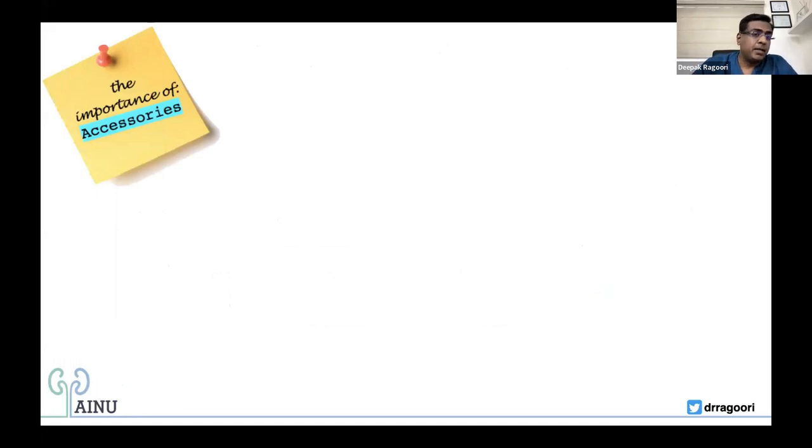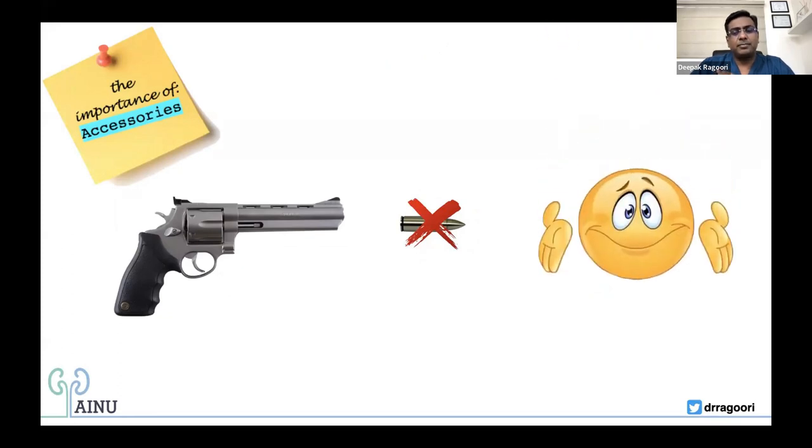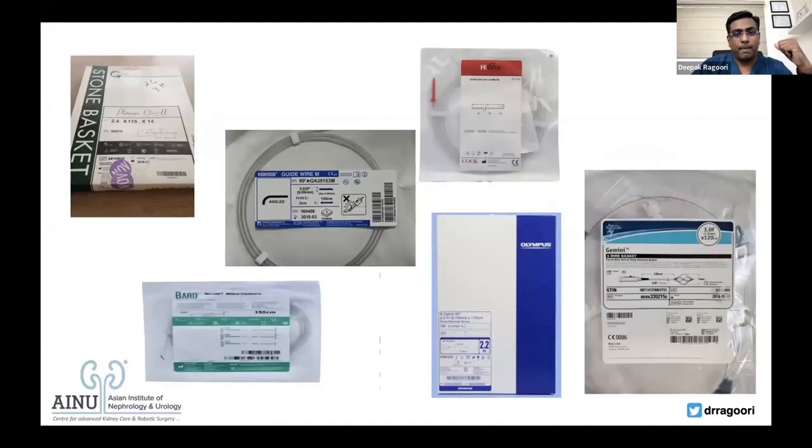So if I have to express the importance of accessories through a tiny animation or an example, imagine you have a very beautiful or powerful handgun in your hand and you realize that the bullet doesn't go in the way it is supposed to. You have lost the battle there. It's totally pointless. Now, to draw the analogy, if you have a wonderful ureteroscope in your hand and you don't have a perfect accessory, say, a laser fiber that doesn't fit in, or a basket that doesn't go through your ureteroscope, or a basket that doesn't actually do the job, then there is no fun in doing ureteroscopy. You can only see the stone and keep seeing it. You will not be able to do anything at all.